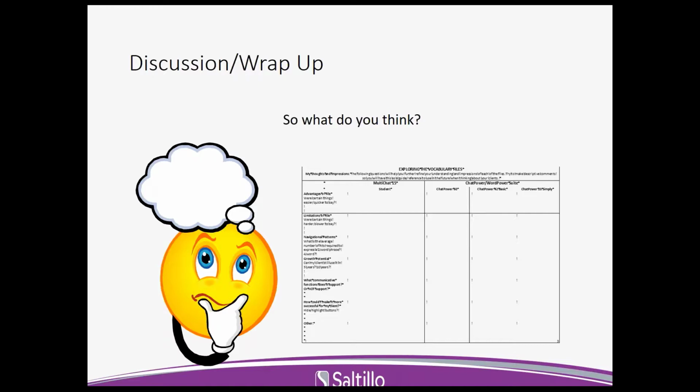What were some of the limitations you noticed in each of the files? Were some of them harder for you to navigate or harder to find vocabulary? Did you notice any navigational patterns? Was it easier to find words, but harder to create sentences when we had less buttons? And what communicative functions did you notice that were supported in each of those, and what wasn't?